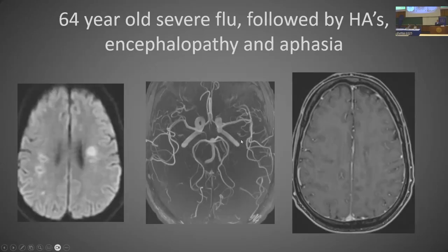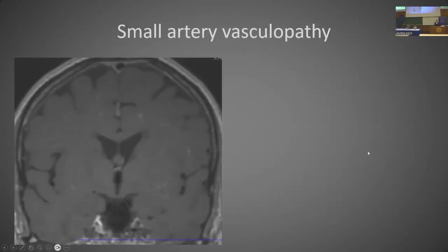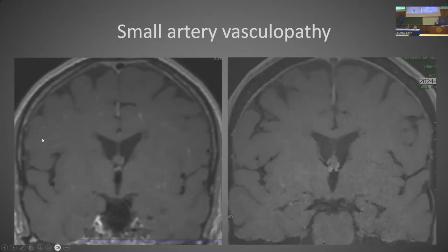The last case I'm going to show here is a patient with bilateral basal ganglia or corona radiata infarcts here. MRA was completely normal in this patient. And on vessel wall, on the MP-RAGE here, post-contrast, it was called normal. I think most people looking at it quickly would call this completely normal. When we did the vessel wall imaging, we saw multifocal areas of curvilinear subcortical enhancement in that kind of perivascular distribution. This patient was treated with immunomodulation after this exam, and that completely melted away.